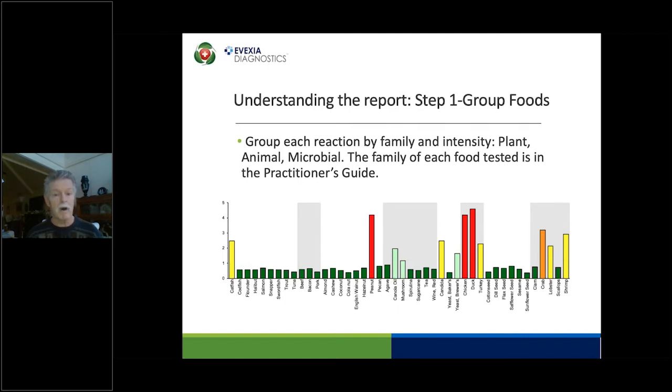And that's very common. And it was traditionally thought that you either produced IgE or IgG. There was no both antibodies at one time. Well, we know today that that's not true. So again, just the nuance. And again, some of this will be pointed out in the new provider's guide. In the next slide.